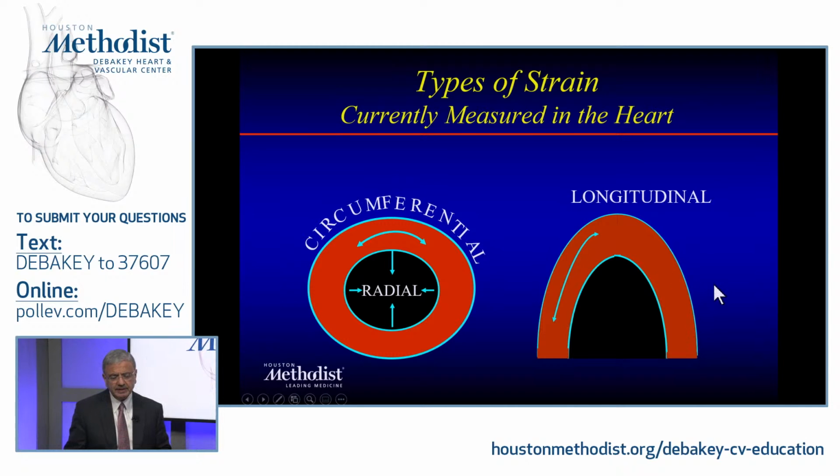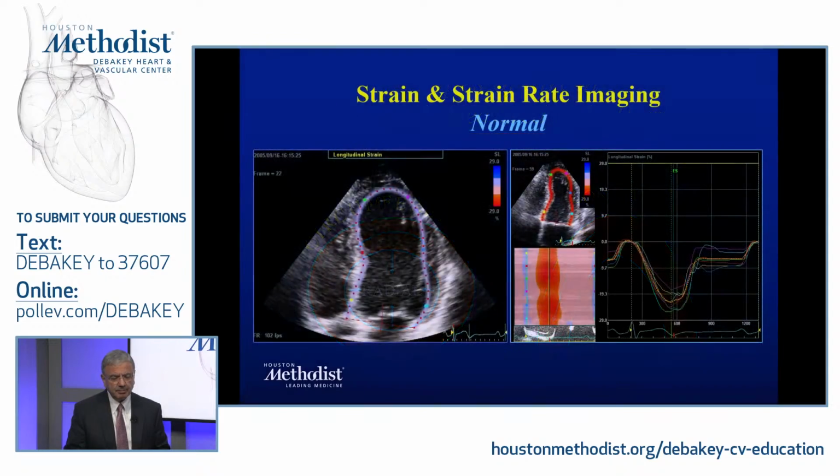Take an example, somebody with hypertrophy. We know that GLS is reduced in patients with hypertrophy, yet the radial strain is increased. So if you think from a functional point of view, for that heart, the output of that heart may be similar or enhanced at times, but the properties of the heart, depending on where the myocardial layers and the orientation of the fibers are, deformed in a different way, and it may have some prognostic implications by themselves too.